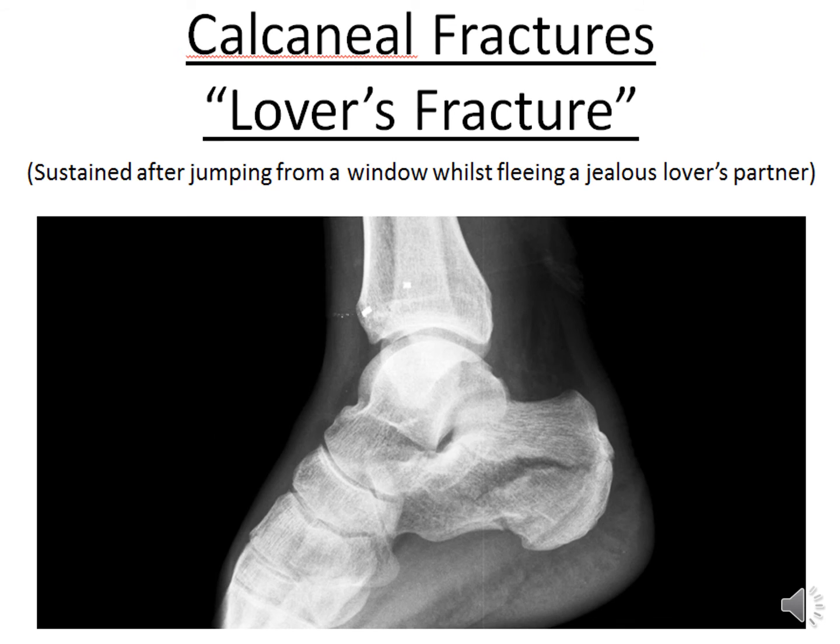Next is the calcaneal fracture. It is also called lover's fracture. It is sustained after jumping from the window. It means for a jealous lover's partner. Here we can see the fracture. We can see the fracture fragment, fracture line here. So this is the calcaneal fracture.